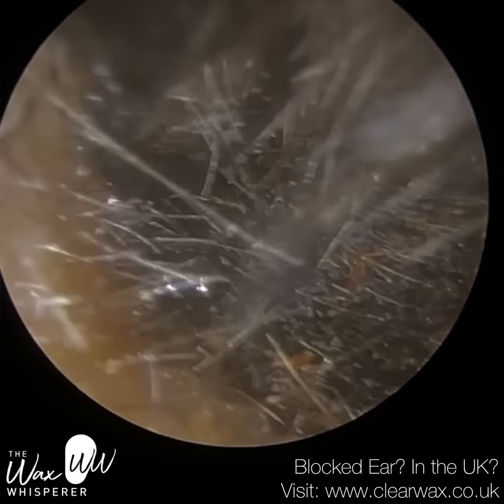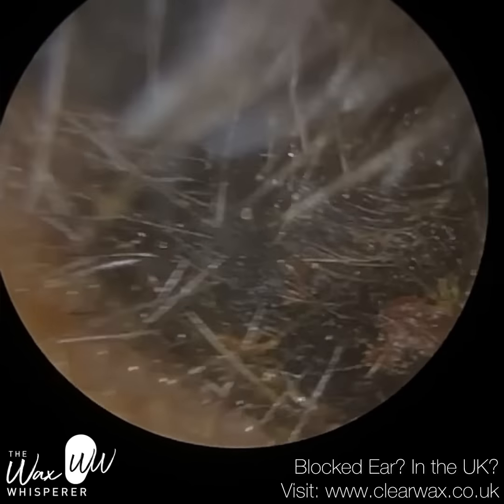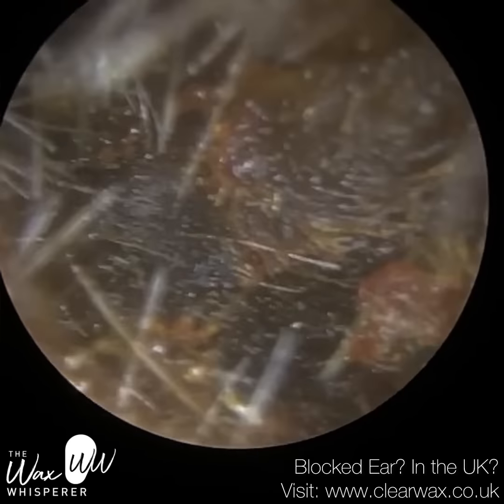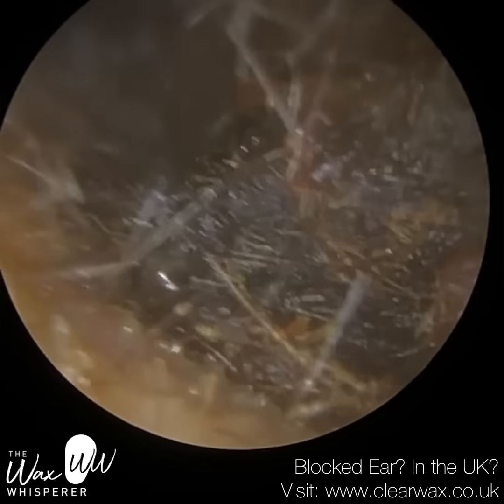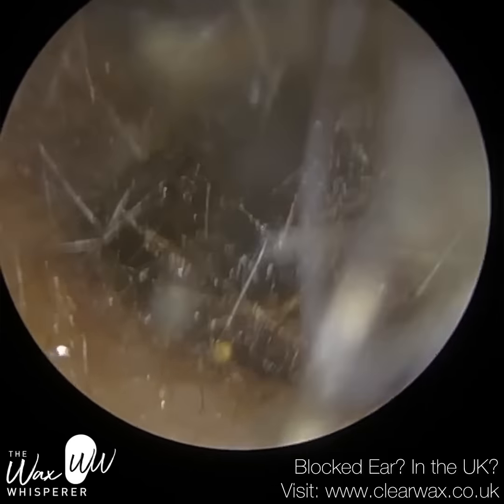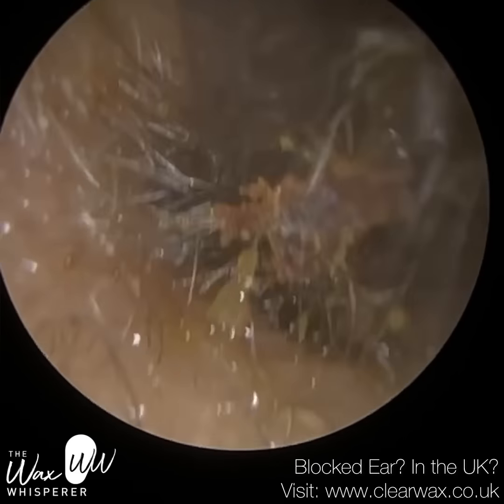I managed to get a bit more out with the curette, but there's still a substantial amount there. The ear hook just dissected through it — it wasn't firm enough — and similarly with forceps, the plug just wasn't firm enough. So I'm just trying to get over and behind it and slowly extract forwards. You can see it's coming out; I think it comes out in a big plug, which we'll see in a moment.